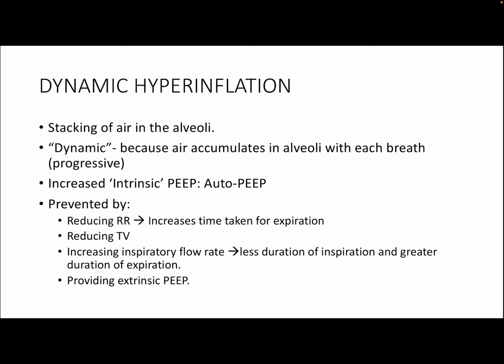Now coming to a really important topic called dynamic hyperinflation. Dynamic hyperinflation means stacking of air in the alveoli. It is called dynamic because air accumulates in the alveoli with each breath. So it's a progressive process. In this dynamic hyperinflation, there is increased intrinsic PEEP, which I've already described as auto PEEP.